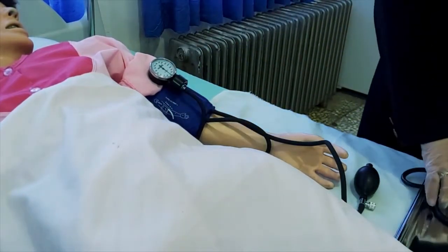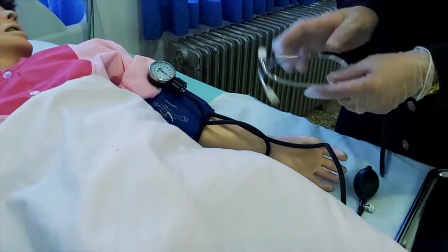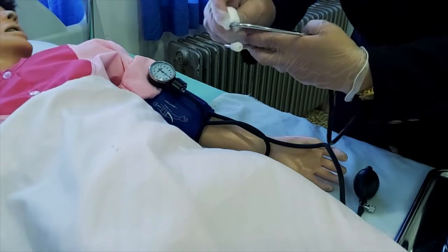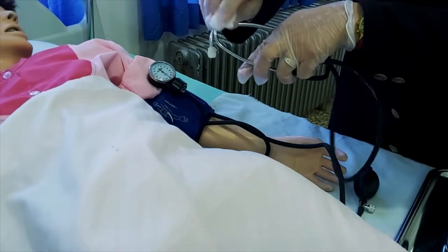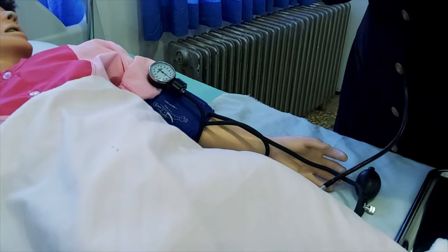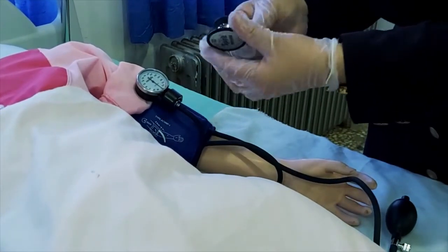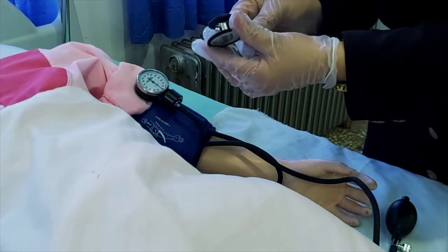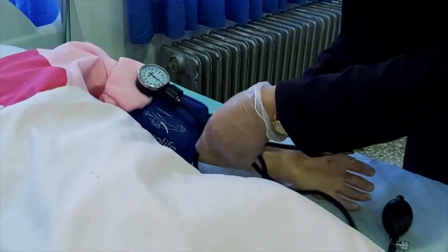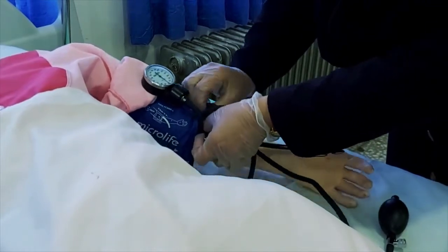مانومتر را هم جایی که قابل رویت باشد فیکس می‌کنیم. گوشی پزشکی را برمی‌داریم؛ قسمت‌هایی که در گوش قرار می‌گیرند را با پنبه الکل ضدعفونی می‌کنیم. کنترول می‌کنیم که قسمت دیافراگم گوشی باز باشد تا صدا منتقل شود. دیافراگم را روی نبض براکیال، دقیقاً زیر حاشیه تحتانی کاف قرار می‌دهیم.